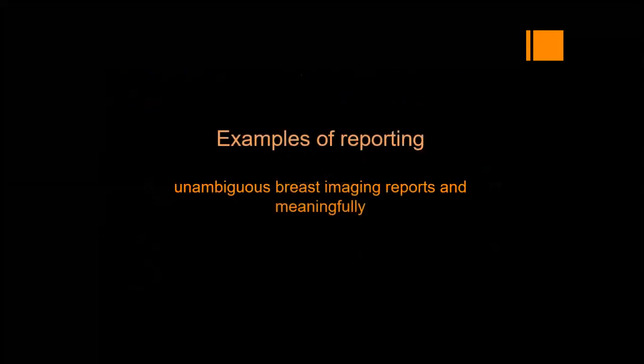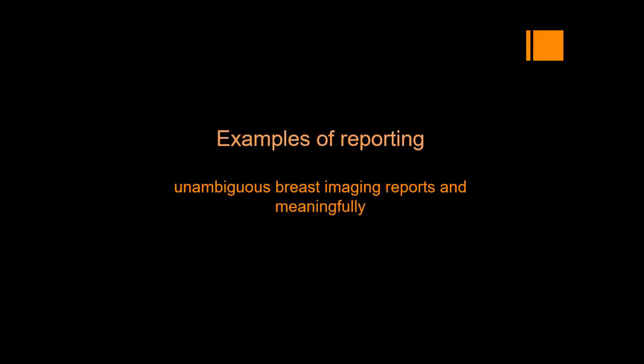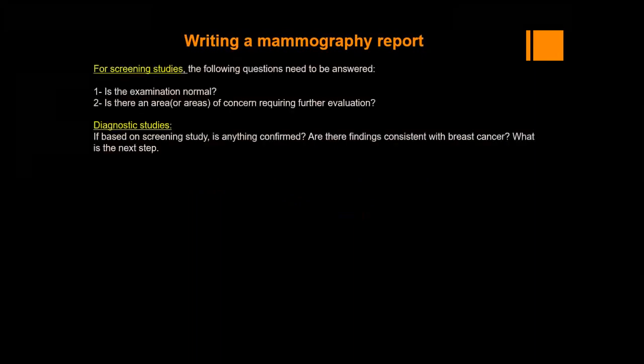So, examples of reporting. The report should be unambiguous and meaningful. When writing a report for screening, the following questions need to be answered.